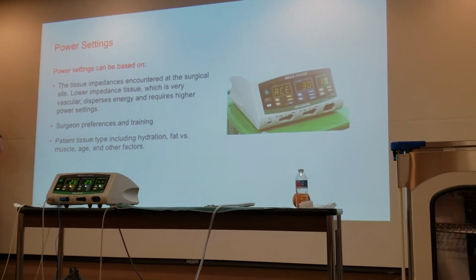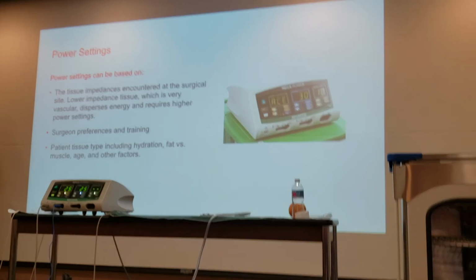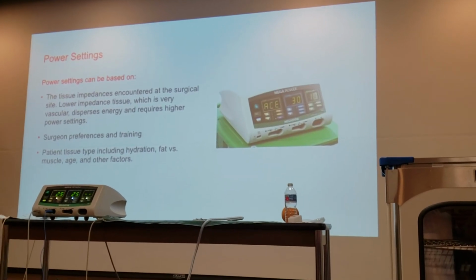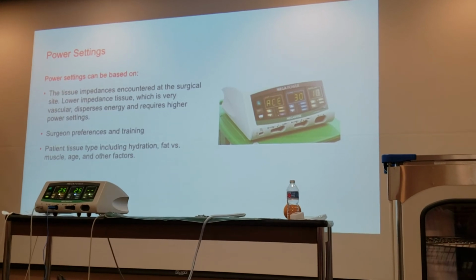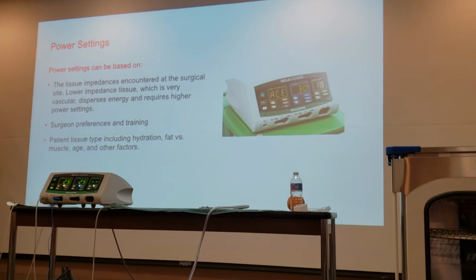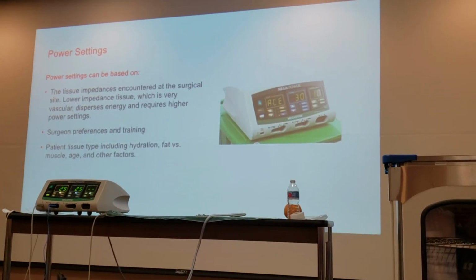But would the truth be every patient that you put on your table is different and probably needs a different setting? Right, yeah, but because our clinicians train the way that they did, it's usually a pretty standard setting that they use.